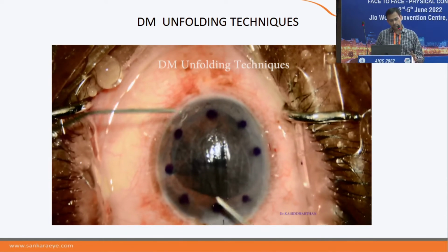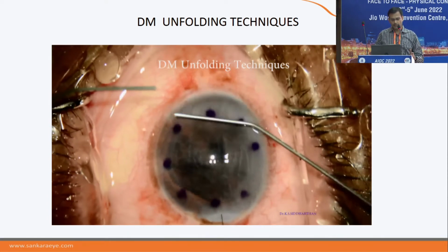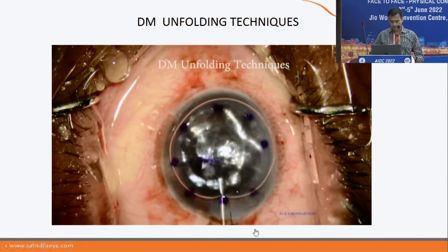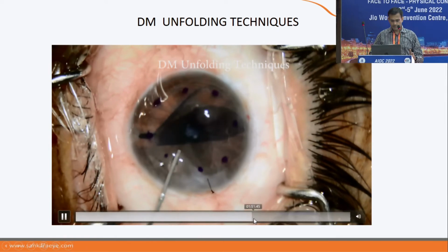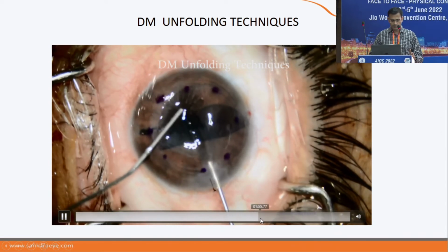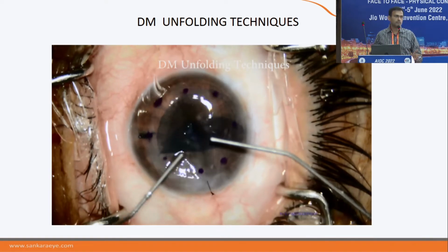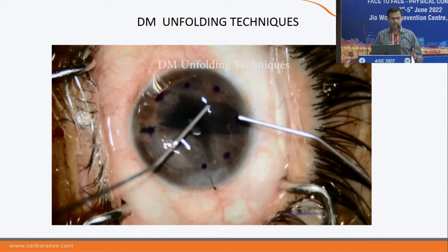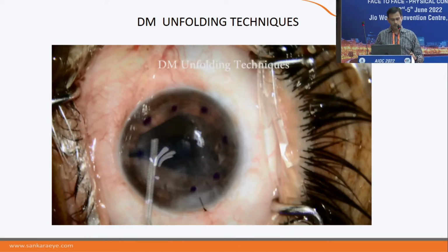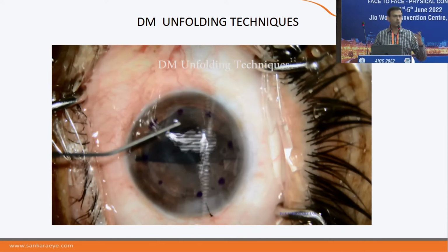But it's not always that this type of unscrolling happens. And you can see here, I've sped it up a little for the time. Sometimes when you try to unfold like this, it might not always unfold. So it was not that easy to unfold, and we used to face these types of problems. So nowadays, generally, we use the hold and release technique.